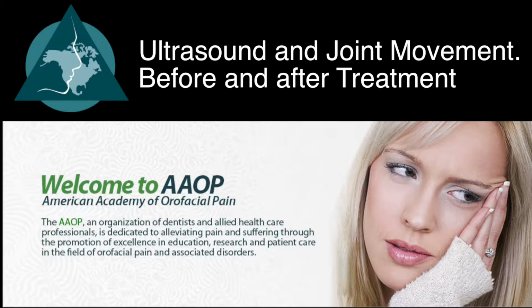Mm-hmm. It's not diagnostic. And a lot of the literature that I was looking up is basically saying you're not supposed to use it as a strictly diagnostic tool, which you're not. You have to use your clinical judgment, medical history, all that stuff, in conjunction with your findings with the ultrasound, with respect to, as it's referred to, MSK ultrasound.